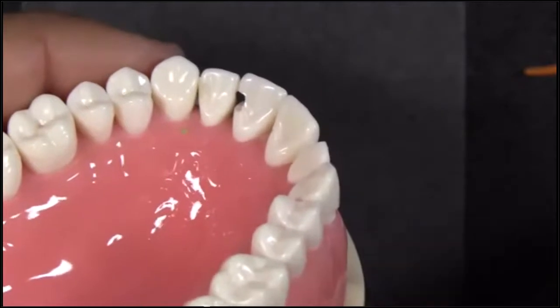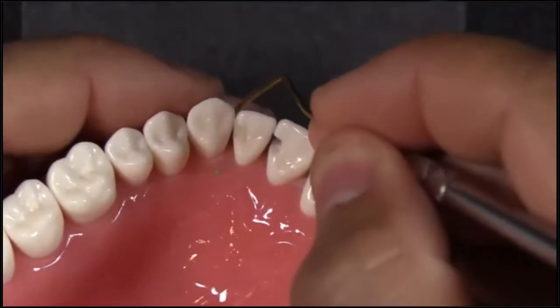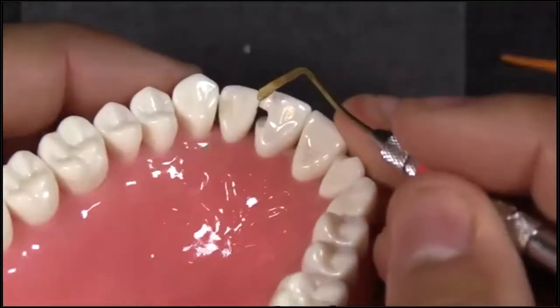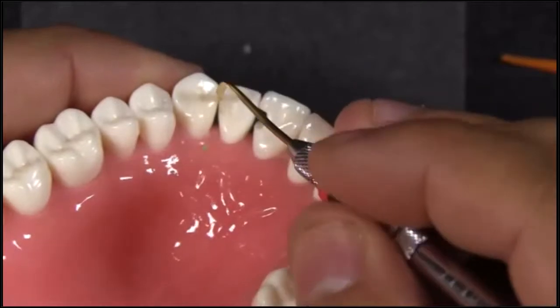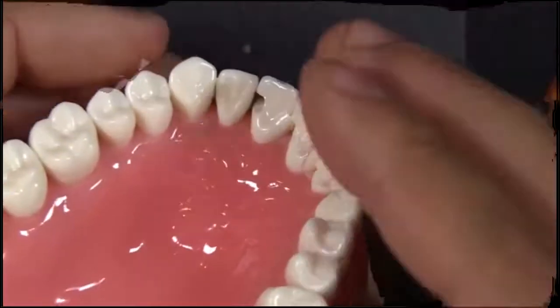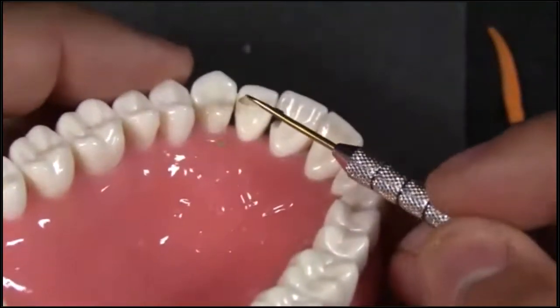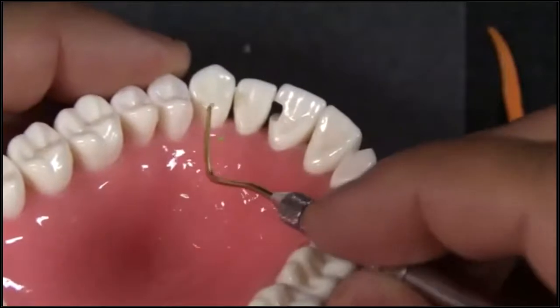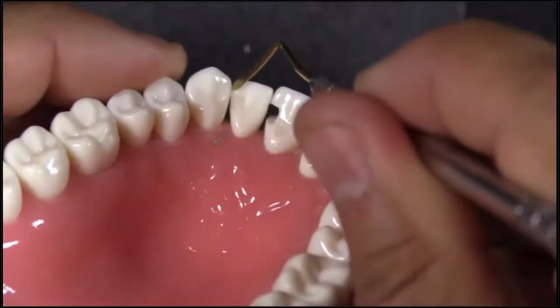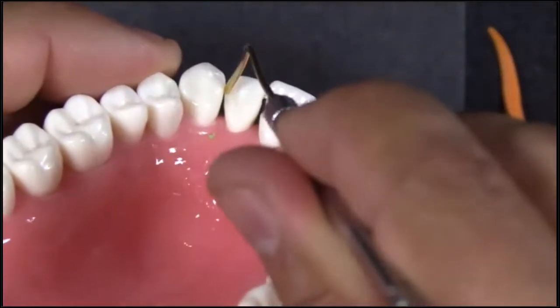A little bit of extra on the facial. And that's kind of what I was talking about with these flexible systems, we don't always get that perfect seal of the matrix band up against the tooth. And how we wrap that around the tooth really plays a big role. So I would give myself a pretty good grade when it comes to how I wrapped it around the tooth and compressed that matrix band in the gingival part, but I had a little bit of excess up in the incisal part of that prep.